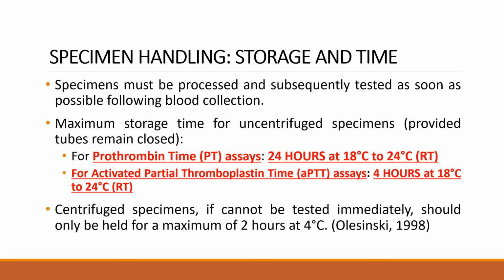Centrifuged specimens, if they cannot be tested immediately, should be held for a maximum of 2 hours only at 4 degrees Celsius. So you have to take note of the condition of the specimen that you are going to test for the coagulation studies.